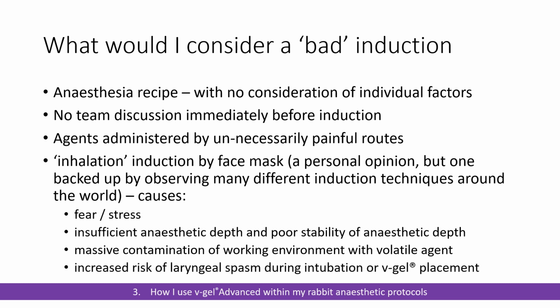One thing that I also find with inhalation inductions, every single time I've seen people doing that, I've heard laryngeal spasms either during intubation or v-gel placements. And that's because of the insufficient anaesthetic depth that you get through these inhalation inductions.